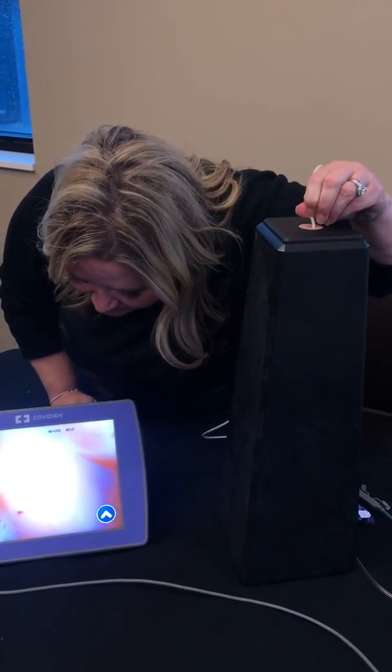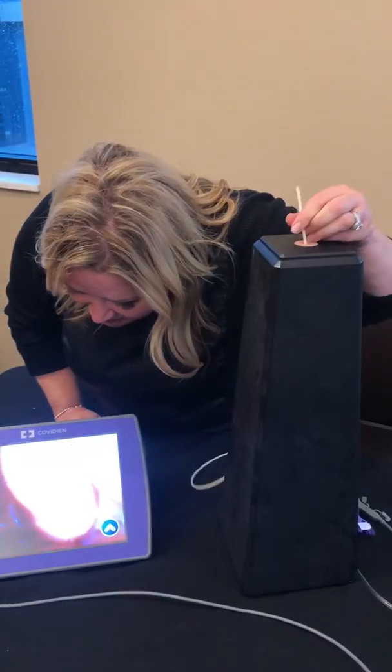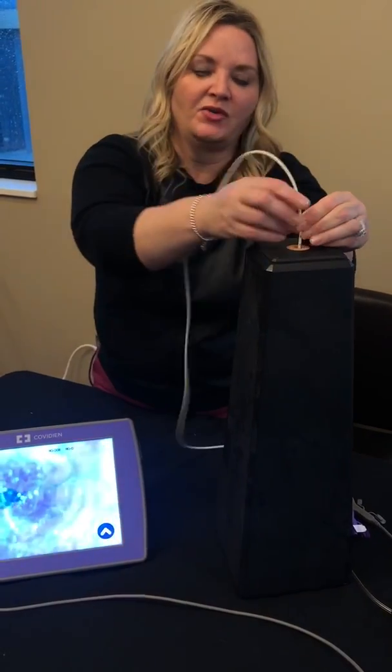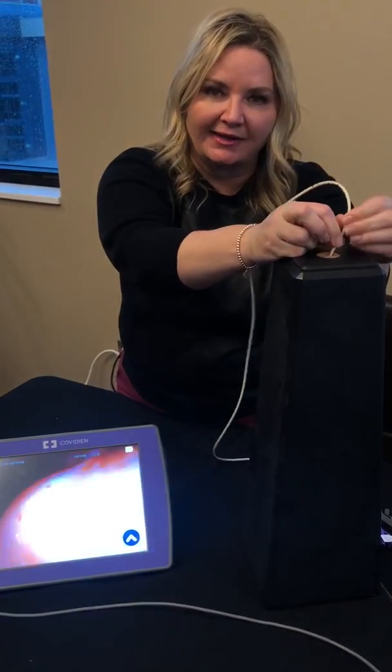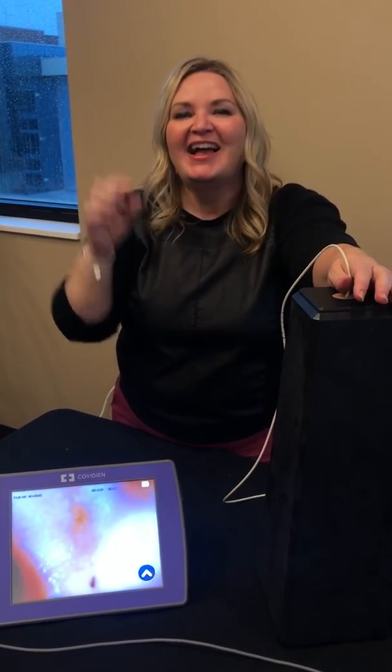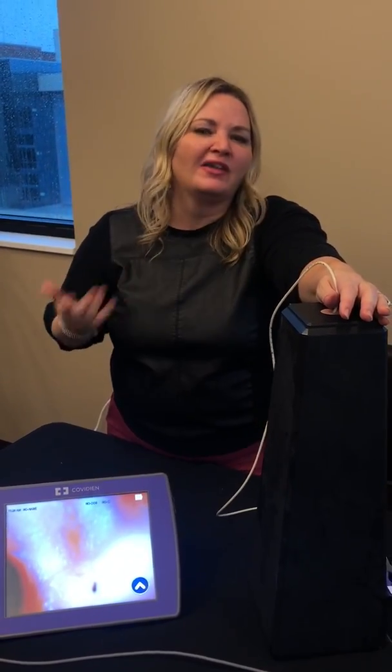How are we looking? You're pressed up against tissue. Yeah, I'm pressed up against it here. Let me try a slightly different angle. And you all know how challenging this is clinically in patients when we're trying to get tube placement. But once you get past the pylorus, you'll see more smooth muscle, little villi and some bile, indicating that you've made it past that junction.